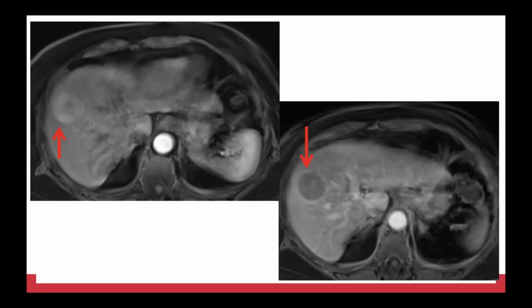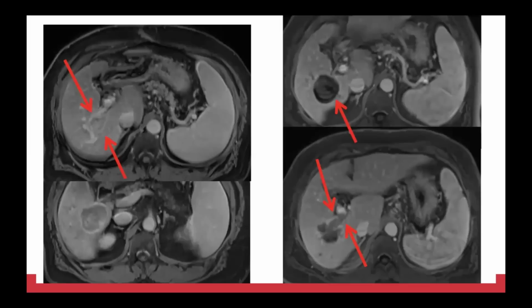So a patient like this, a single tumor, 3-4 centimeter, well encapsulated, this patient will get better by pretty much any therapy. Surgical therapy, if it is feasible, local regional therapy, systemic therapy. I mean, this patient will do pretty well based on what you see. A patient like this, a nicely circumscribed tumor, however, has an extension of tumor into the portal vein. So this is probably PV1 or PV2. This patient, despite its advanced stage by BCLC, despite its portal vein invasion, will do pretty well. This is one of my patients, and he's doing well 4 or 5 years out, which is not supposed to be based on the BCLC criteria.